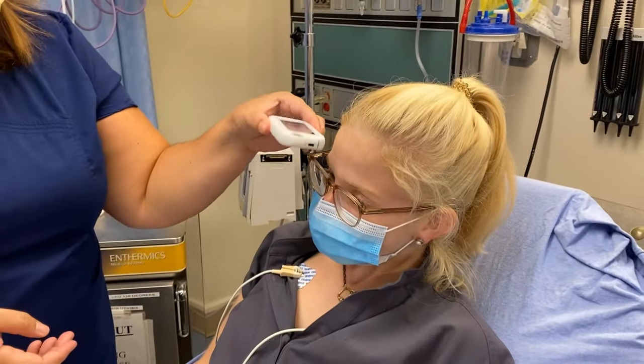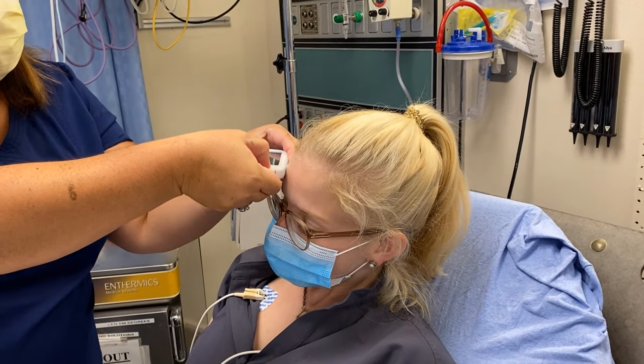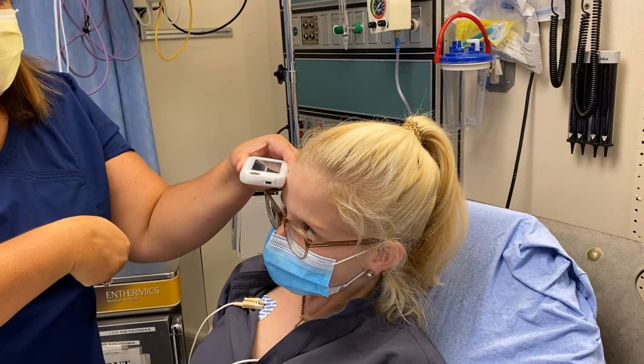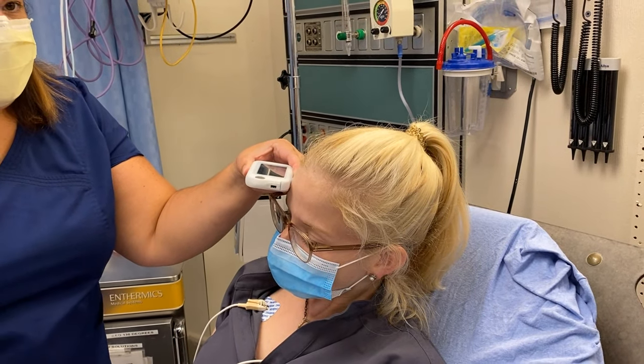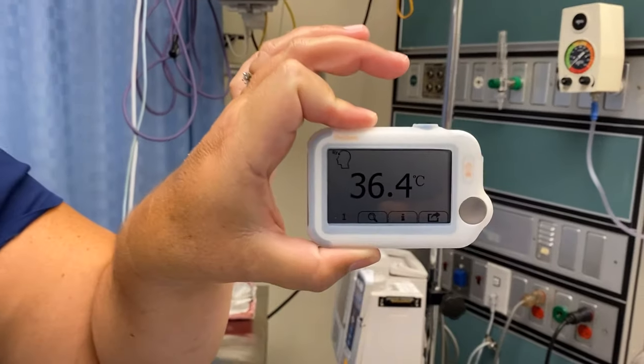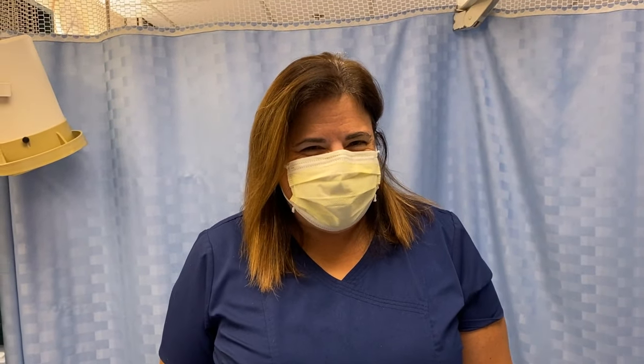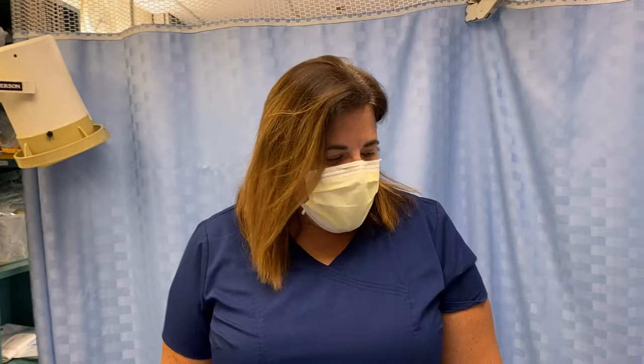98.5 — so you just set it on her forehead and hold this button until it beeps. 36.4. And what did we say it was? She was 36.8. This is Kim Litweiler, she's one of our nurse practitioners, and she's going to be a subject matter expert here on our new device.